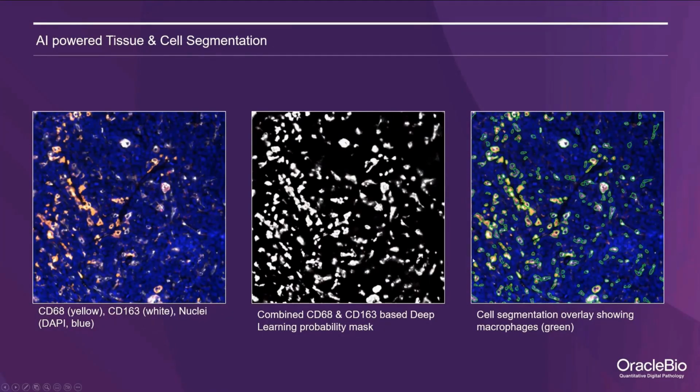From here, then, we use a set of post-processing steps in Vis to create individual cells based on the shape and size parameters as shown here on the right. We therefore can end up with different apps tailored to create different cell lineages to be detected. The next step then is to threshold and phenotype the detected cells.